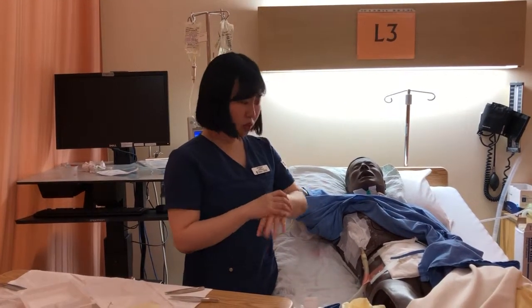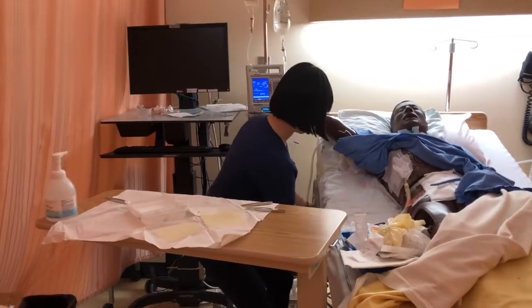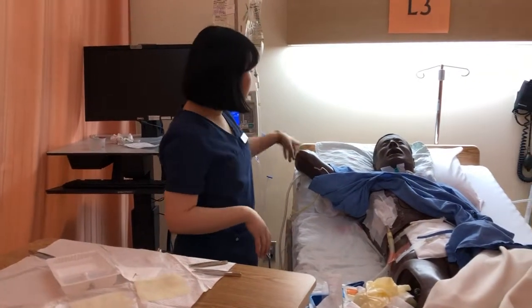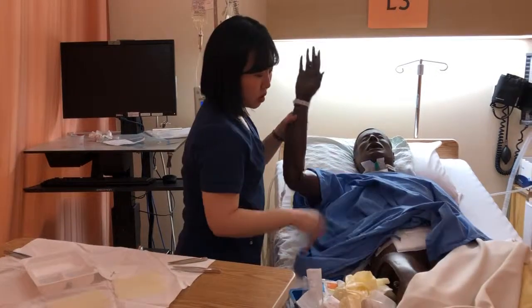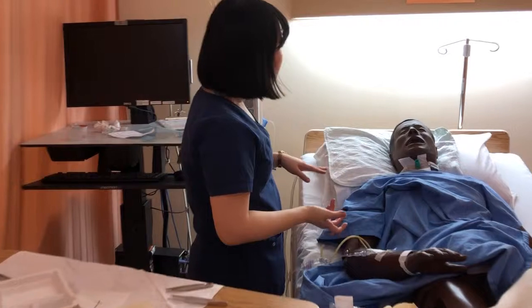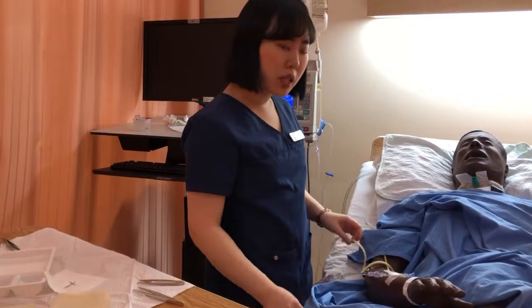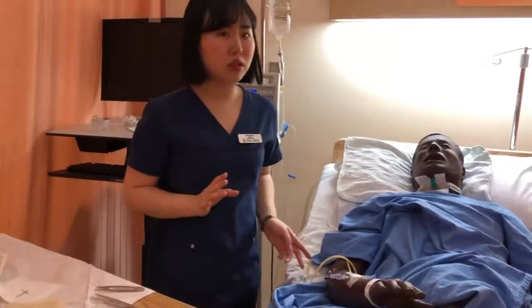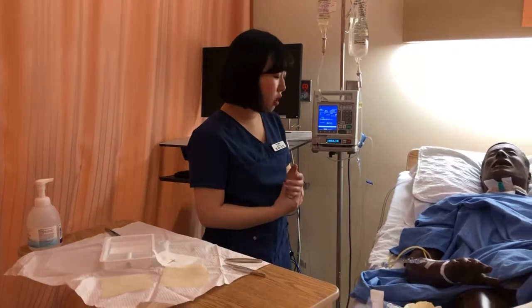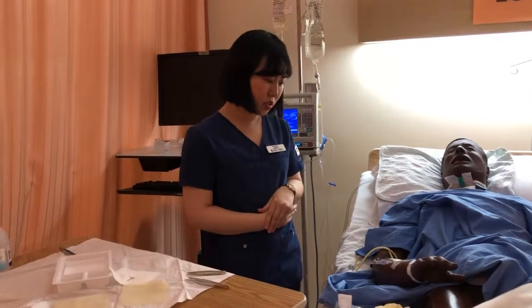And I'm gonna do the exit safety check. So I'm gonna put the bed rails up and put the call bell within reach. Put the patient in a comfortable position, but for the purpose of the video, I'm gonna clean it later. And no visible hazards. I'm gonna lower the bed to the lowest level for fall risk. And then also the medication is going well. Yeah, that's exit safety.